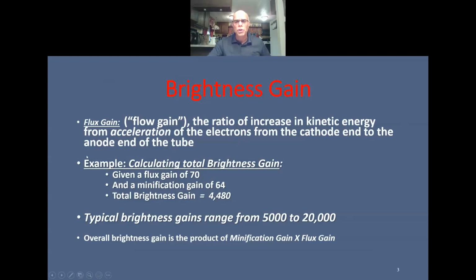This is really true, but it's telling you the mechanics behind it. So I would say that the ratio, or flux gain, as those electrons are flowing through, is the output of the light photons coming out of the output phosphor against the number of X-rays going in? That is your flux gain.